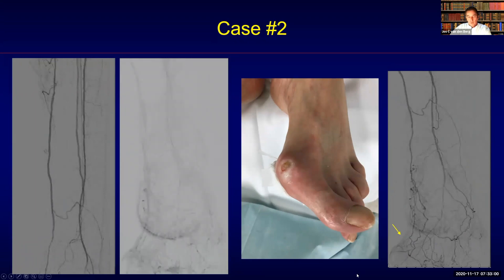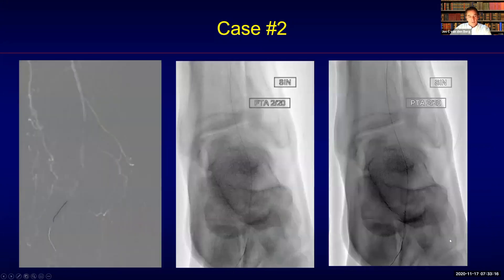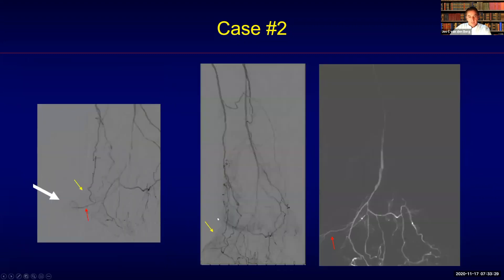We still had the problem of the anterior circulation not being optimal. We completed the procedure by crossing in the forefoot with an 0.014 guide wire and again using a very short and small balloon to dilate up until the distal segment. In the end, we have a complete revascularization of the area involved.